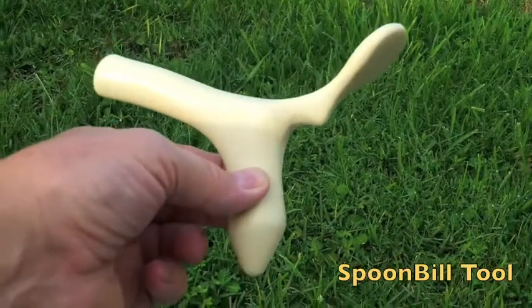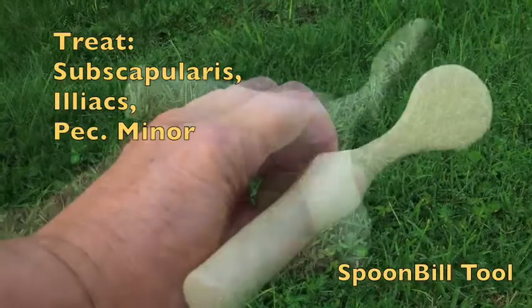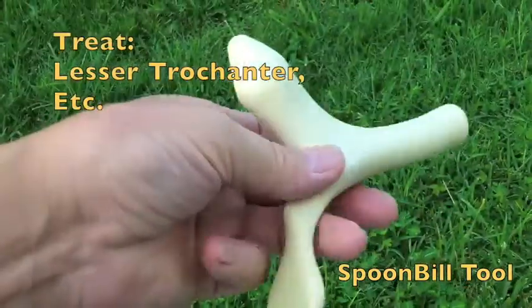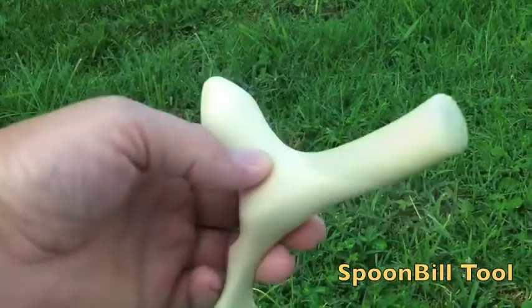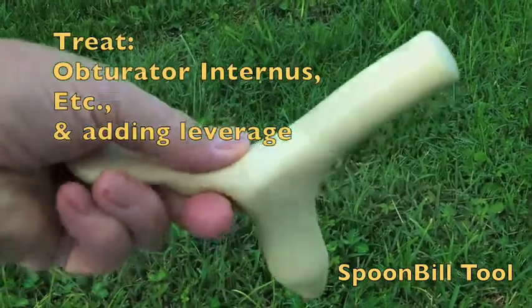Here's the new spoonbill tool — called that because it has a bird's spoonbill shape. It also has a rounder point and a very long, we could call it a T-bar tip on this end. This is great for getting into the obturator internus up underneath the ischial tuberosity.